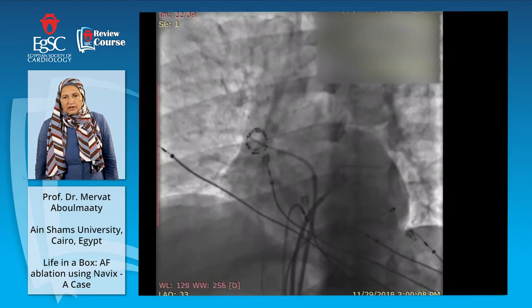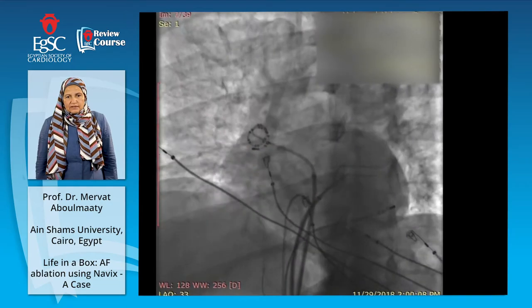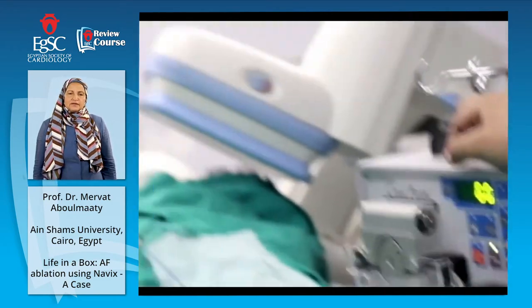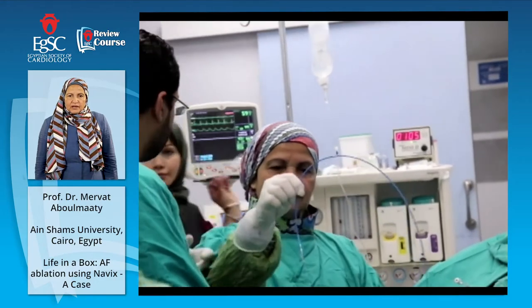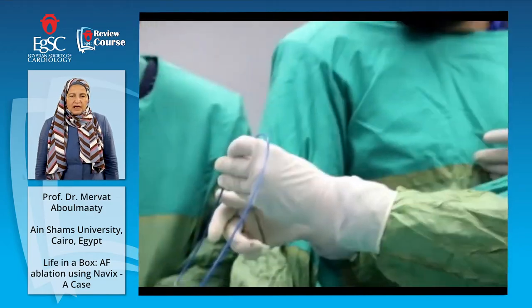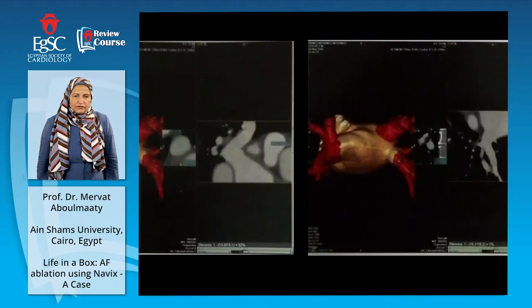We are injecting dye through the needle to make sure that we are in the left atrium, making sure everything is perfect. Then we deliver the sheath through the guide wire and the dilator. We take off the dilator and the guide wire, the sheath in the left side, everything should be flushed. And we prepare the irrigated tip catheter.